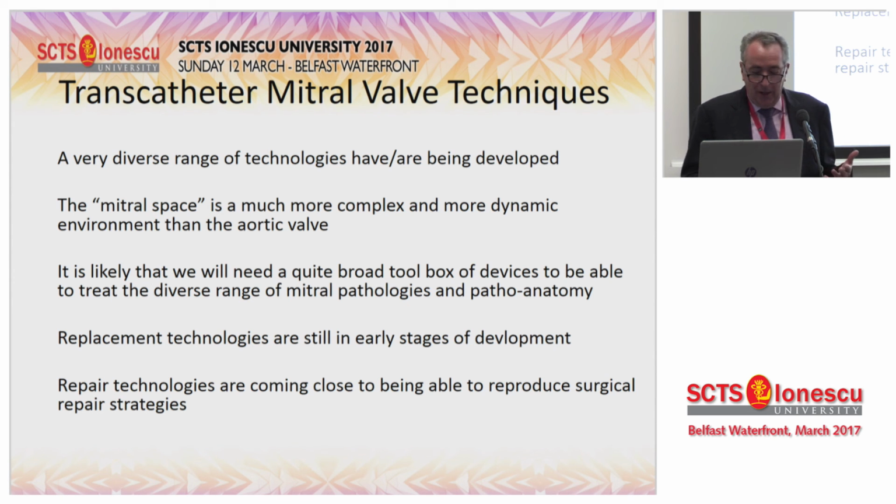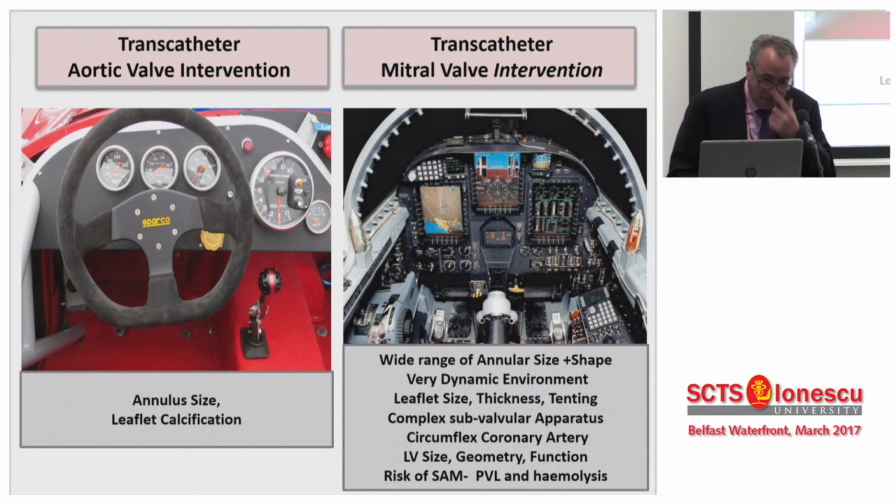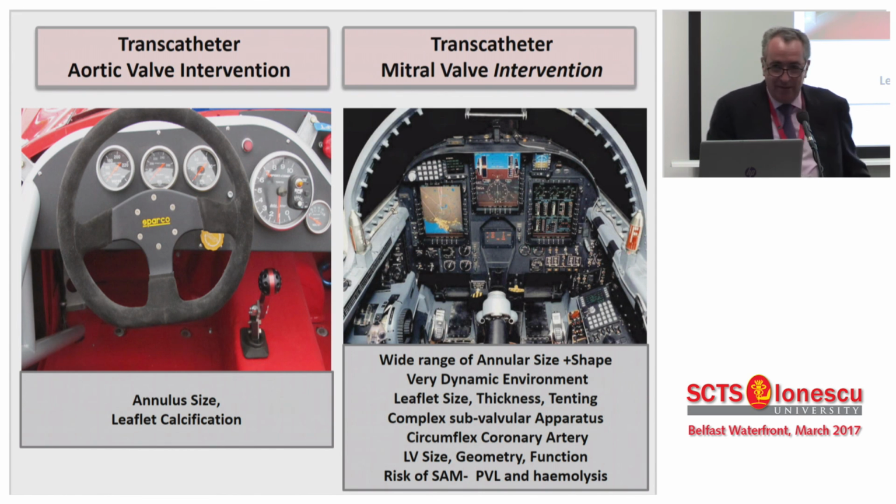And I think, as I've shown you, I hope repair technologies are coming close to being able to reproduce conventional surgical repair strategies. This is an old slide of mine. I think this is TAVI. Anybody can drive one of these. It's quite simple. You can teach anybody to do it. This is transcatheter mitral valve intervention. Much more complicated, much more difficult. It's going to take a while to sort that out.